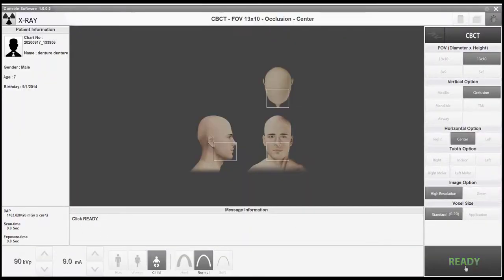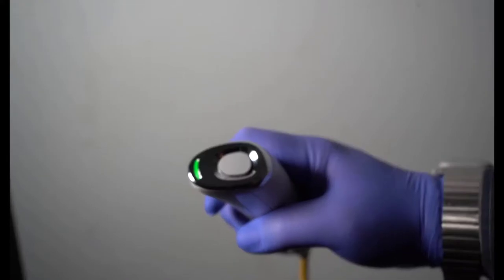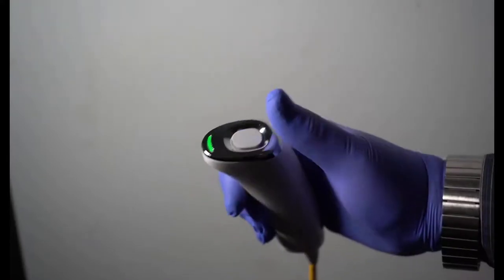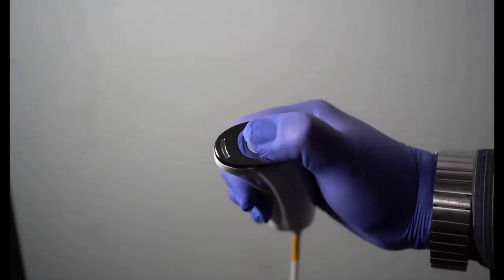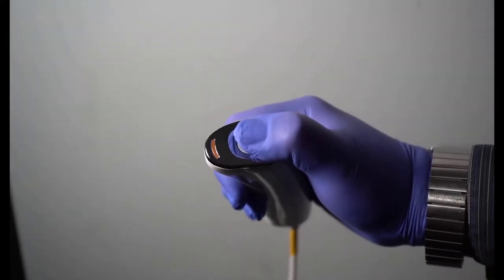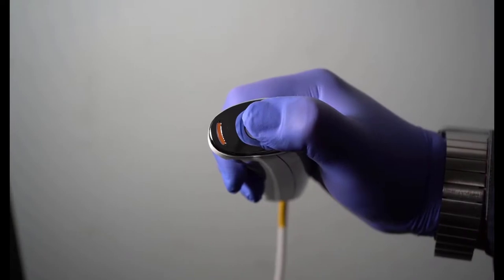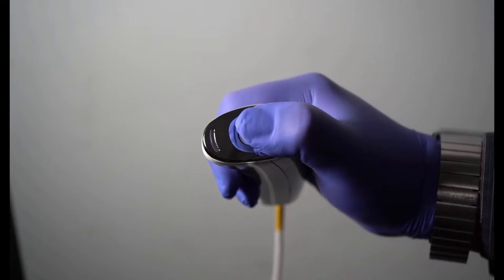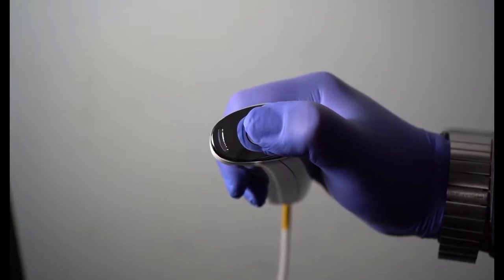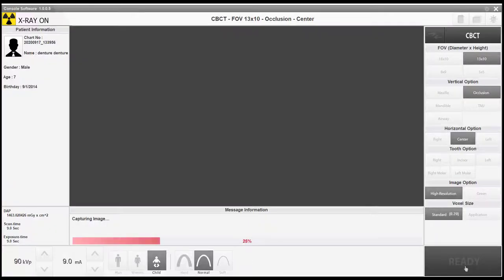Step out of the room and press and hold the exposure button. The hand switch indicator will illuminate orange while exposing. Release the button when the light no longer illuminates.